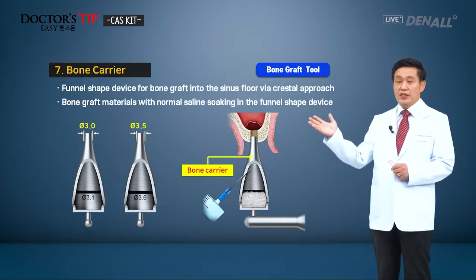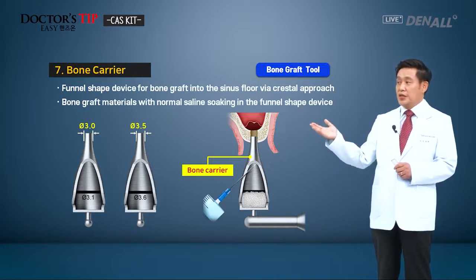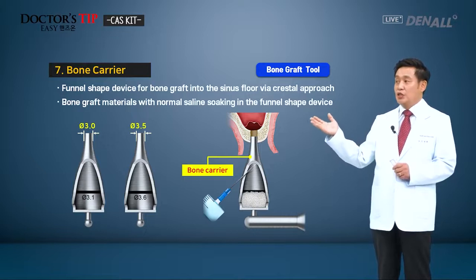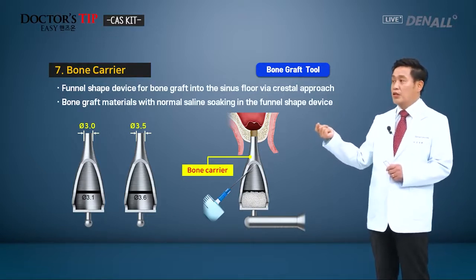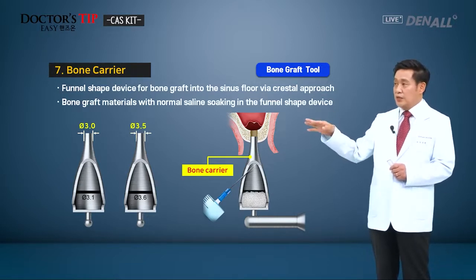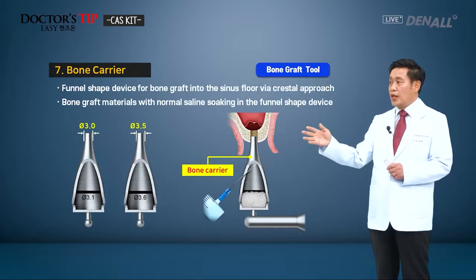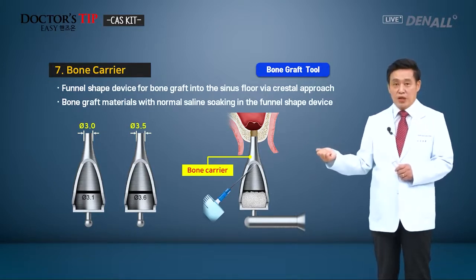Next, the bone carrier. It is shaped like a funnel. The 3.1 drill hole uses the 3.0 carrier. It is 0.1 millimeter shorter in diameter. So graft material can be put into the funnel shape safely, and it is hydrated and pushed up.